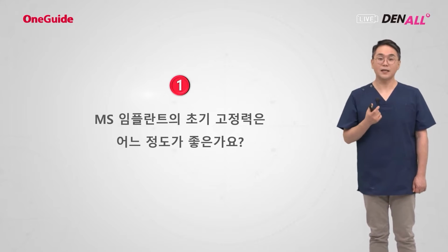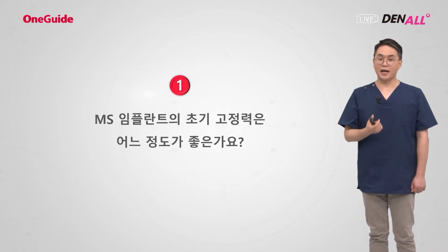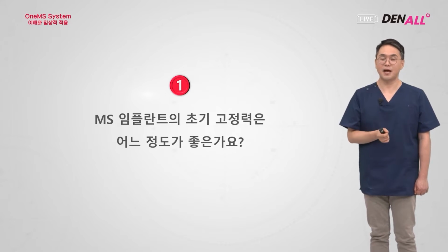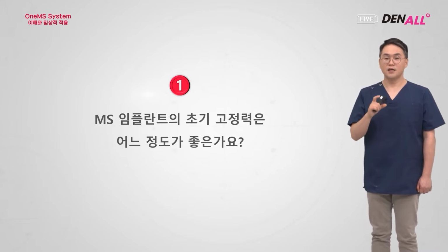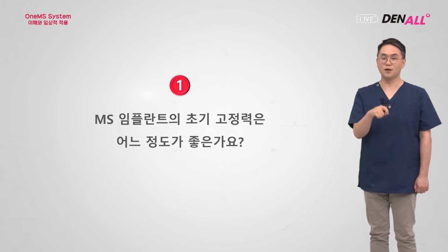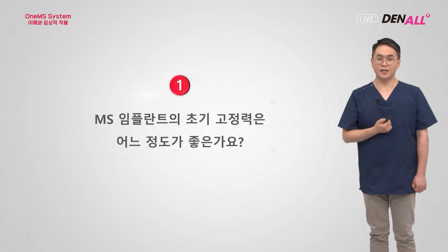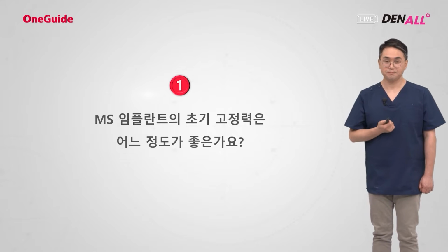And if I may share my own tip, for the diameter, I just drill up to the guided line. So for a 2.5 implant, I drill up to 1.8. Using the depth, I control initial stability. For a 10 millimeter MS implant, the drilling depth will be about 8.5, and using the remaining 1.5, I try to secure initial stability. After placing an MS implant, you usually have to do immediate loading.